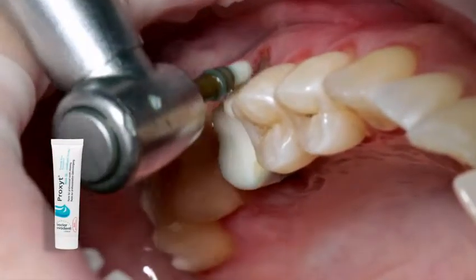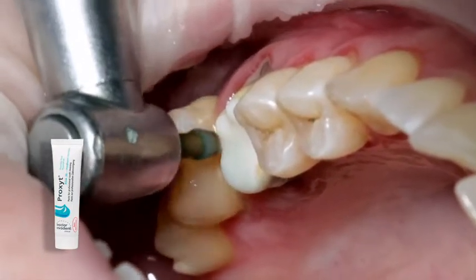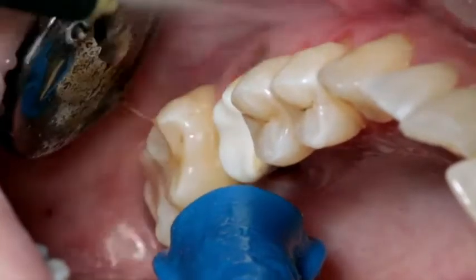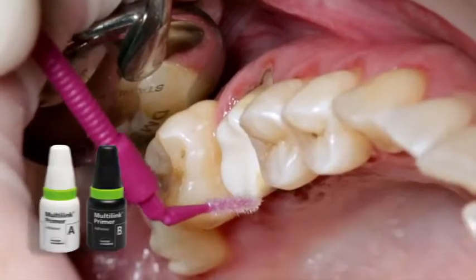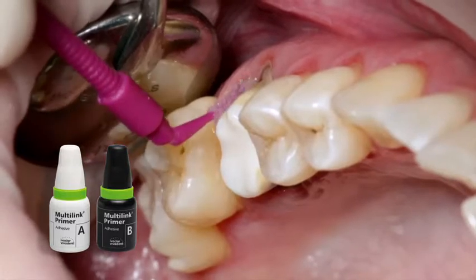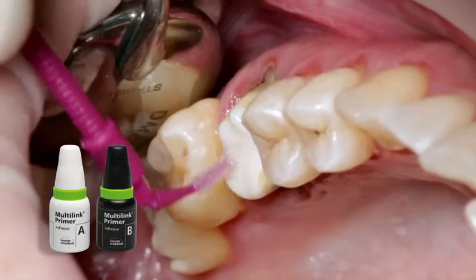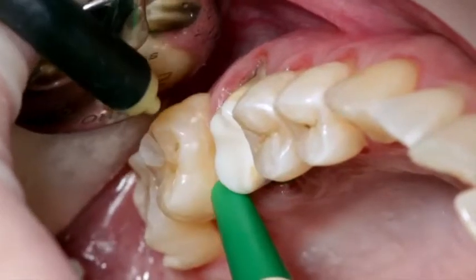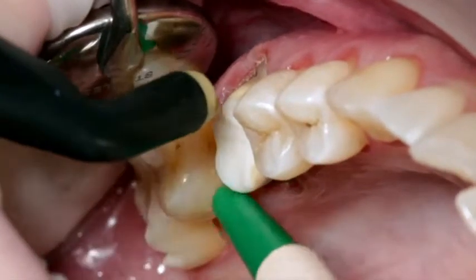Prepare and clean the preparation again with a polishing brush and a fluoride-free cleaning paste, such as Proxite fluoride-free. Afterwards, rinse the preparation with water spray and dry with air. Avoid over-drying of the preparation. Apply the mixed Multilink Primer AB onto the entire bonding surface using a microbrush and scrub it for 30 seconds, starting with the enamel surface. Disperse excess Multilink Primer with the stream of air until the mobile film disappears. The primer is self-curing and no light curing is required.